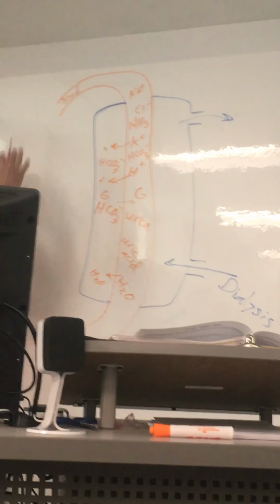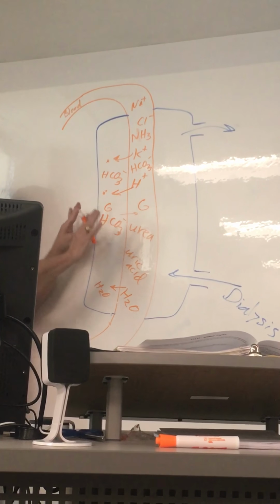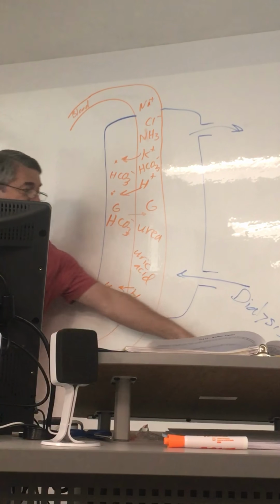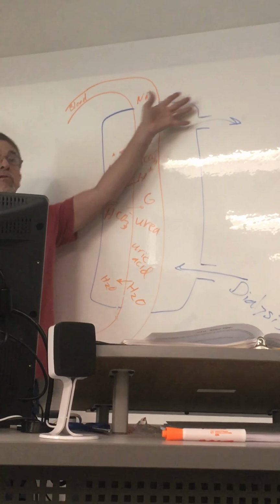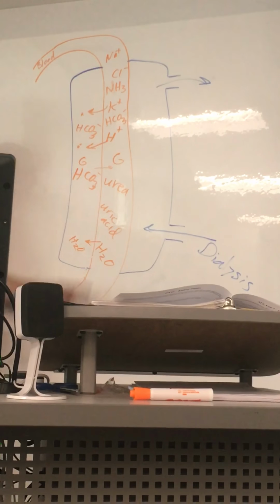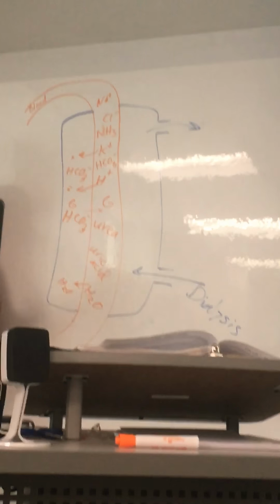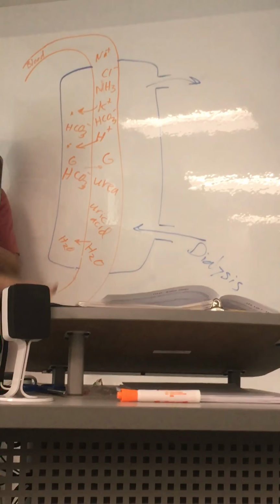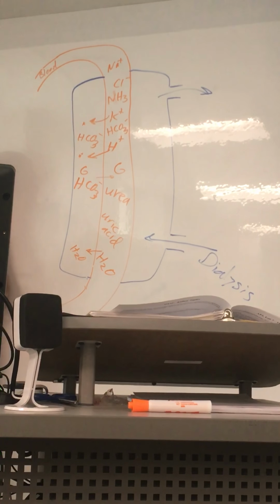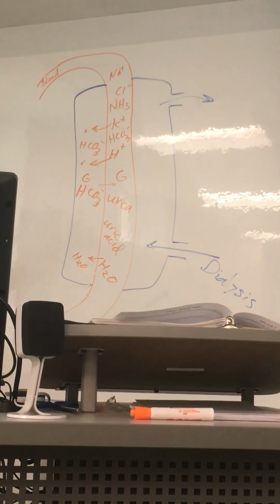Okay. Remember now, both of these things are in constant motion. This is not fluid A sitting beside fluid B and you reach equilibrium. That's not happening at all, because you are constantly making the dialysis fluid move, and you constantly have fresh fluid, and your blood is constantly moving past it. It's kind of like Henry's Law. See? You're going to pick up the values of what you went past, and that is the way it's actually going to happen here, not reach equilibrium. Okay. Does that make sense? Yes. So that's it.